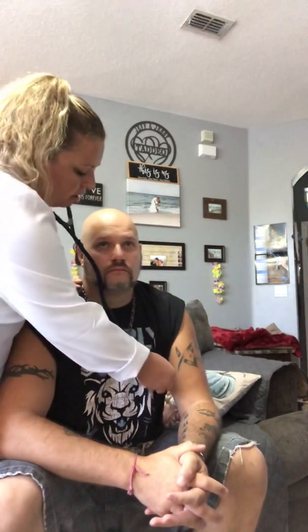While I'm back here, I should go ahead and listen to the lungs. I'm going to go ahead and listen to all the lungs. I'm going to listen anteriorly. And posteriorly. Go ahead and lift up his shirt.